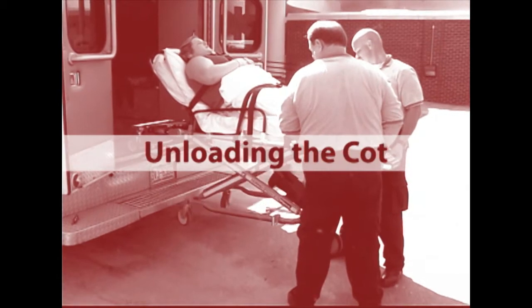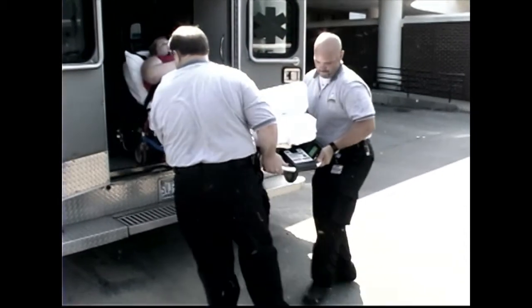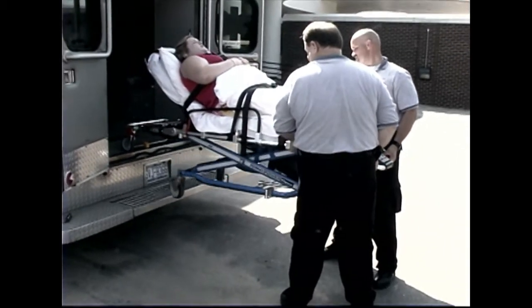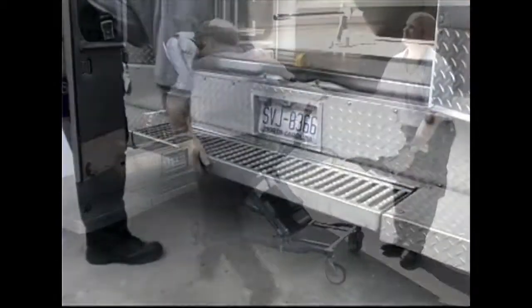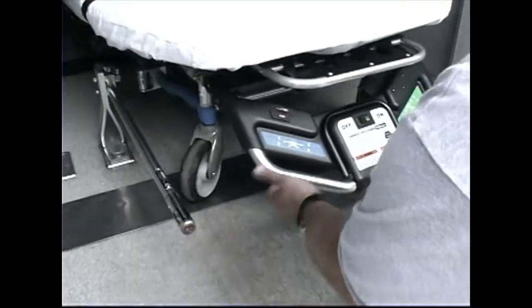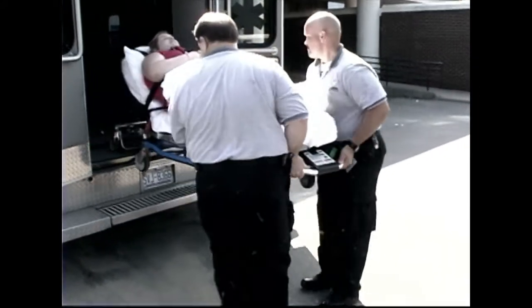Unloading the cot. Unloading a cot with a patient on it requires a minimum of two trained operators working together. Both operators may stand at the foot-end corners of the cot while unloading it. To unload the cot, raise the ambulance folding bumper if present and release the cot from the cot fastener. Both operators then work together to pull the cot out of the ambulance until the safety hook on the ambulance floor catches the safety bar on the cot.